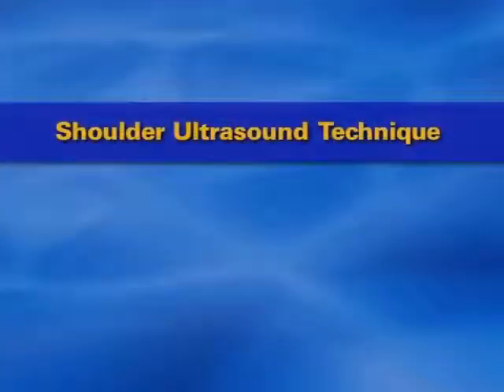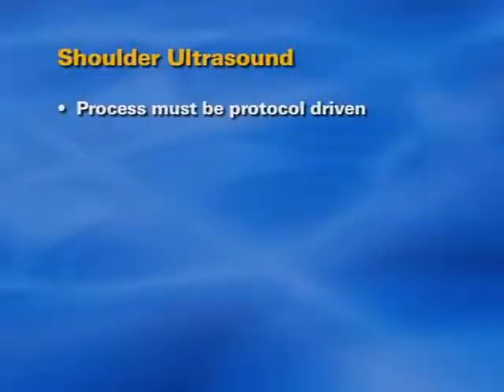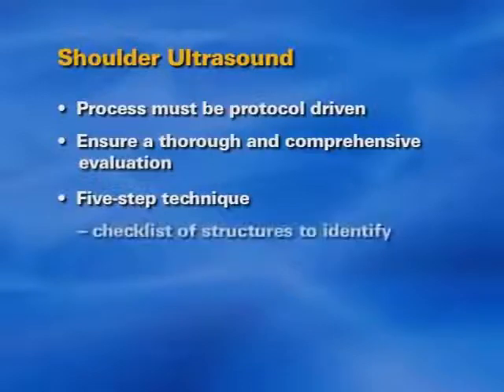In this video, I will demonstrate how I complete a shoulder ultrasound examination. It is important that this process is protocol-driven to ensure a thorough and comprehensive evaluation. My shoulder ultrasound examination is divided into 5 steps, where each step has a checklist of structures to identify.